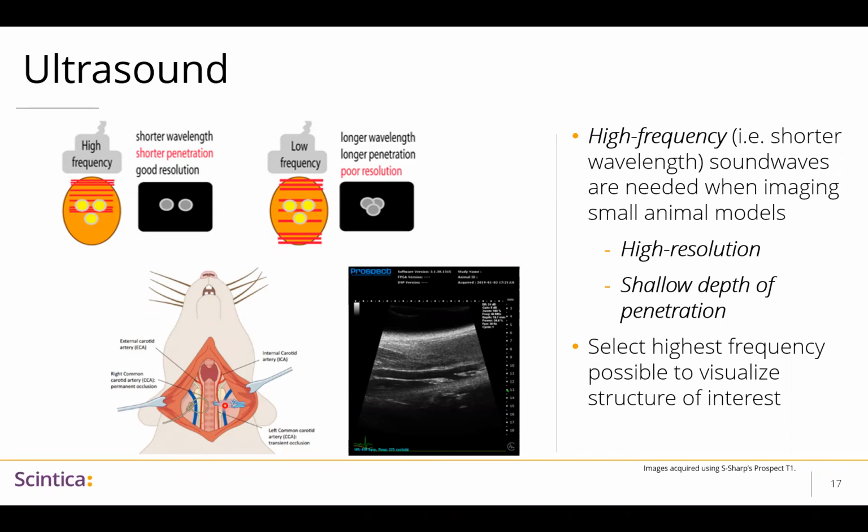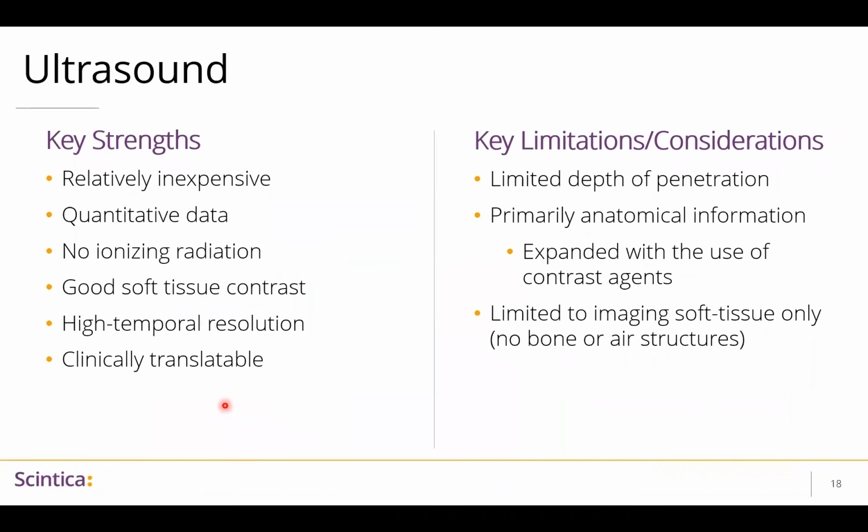So when we're talking about ultrasound, it's most important to keep in mind your imaging target and how deep it is so that you can select the highest frequency possible that still allows you the penetration to be able to see your target of interest.